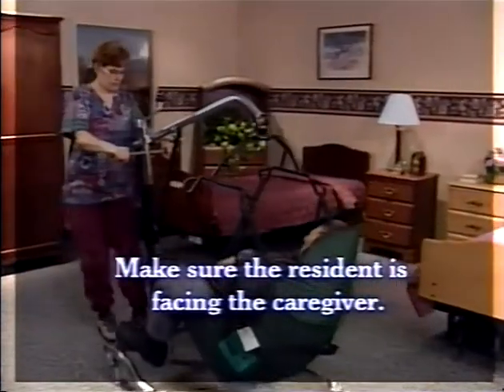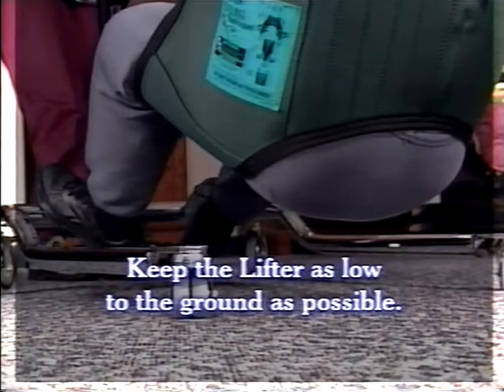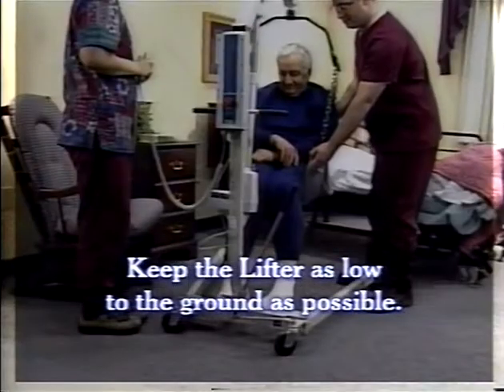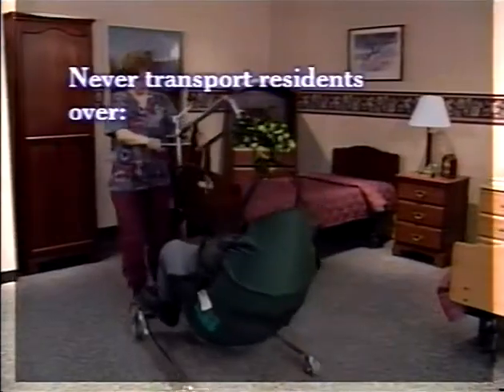Lifters are designed for transferring people. Transporting people over longer distances should be done with the proper equipment, such as a wheelchair. However, if it ever becomes necessary to transport someone for a short distance, make sure the resident is facing the caregiver. Keep the lifter as low to the ground as possible. A low center of gravity reduces risks and results in a smoother, more secure ride.